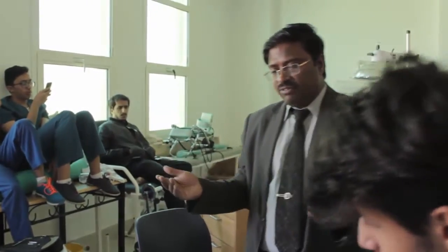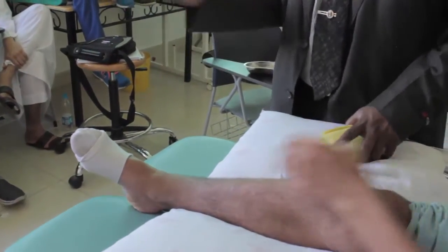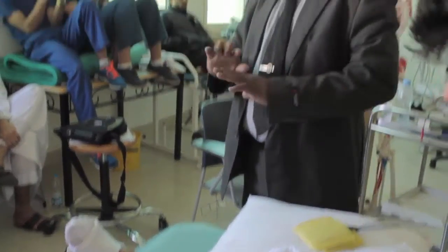How much time it takes for number of muscles, number of repetitions will differ. For example, this 30, 30, 30. Other group 30, 30, 30. So how much time it takes, that is the duration. But usually you can start with the 20 minutes or half an hour, then you can increase whenever it is necessary.